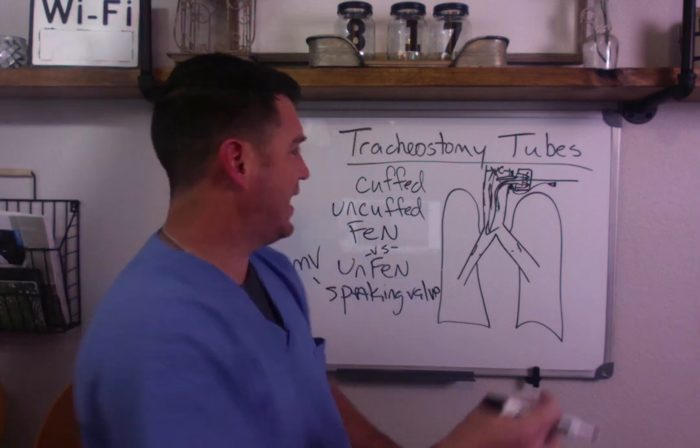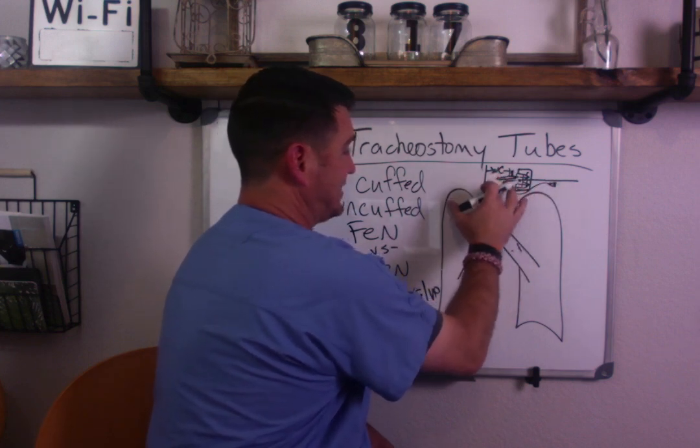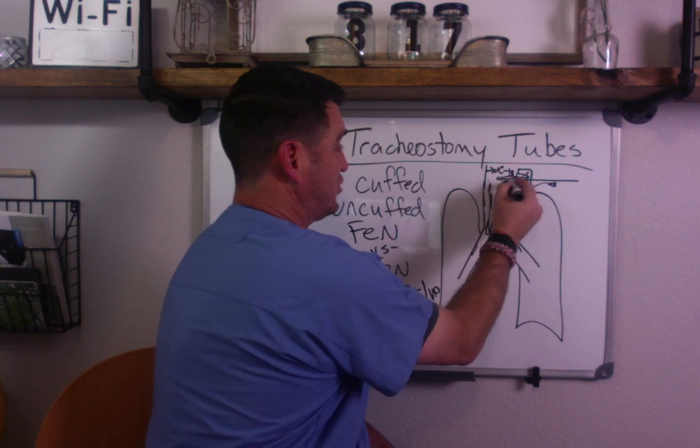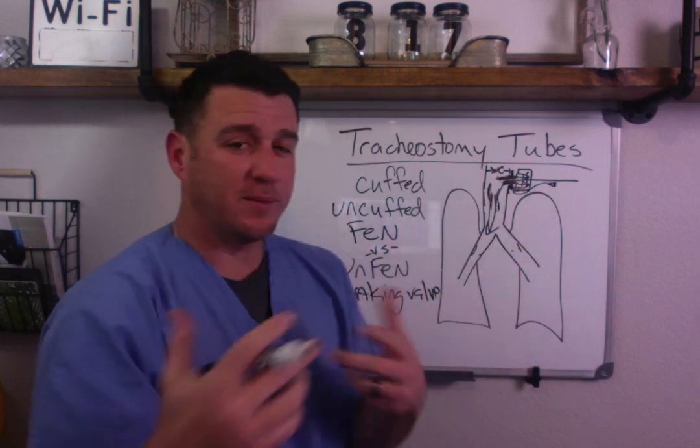We don't want that. Now, as I talk about the fenestrated tracheostomies, I've got a bit of a mess here, but I'm going to do the best I can. Remember, you have a hole right here, right? What do I need to remember?